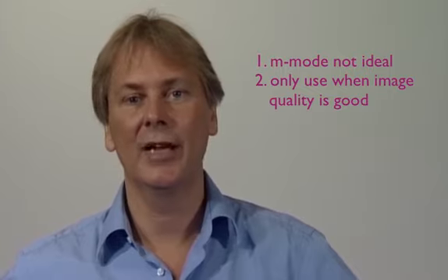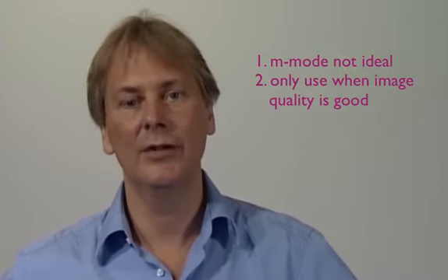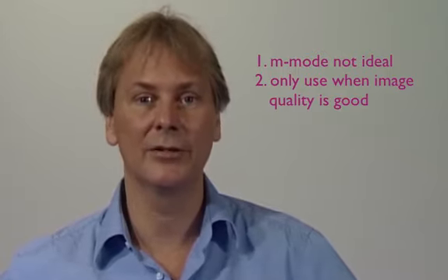I personally believe that the M-mode is probably not the best way to really quantify left ventricular hypertrophy. It should only be performed in patients where you have a good image quality. I think that you should prefer 2D measurements or other measurements such as mass calculations if you really want to get reliable measurements.